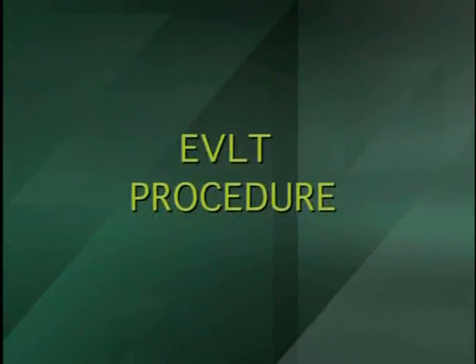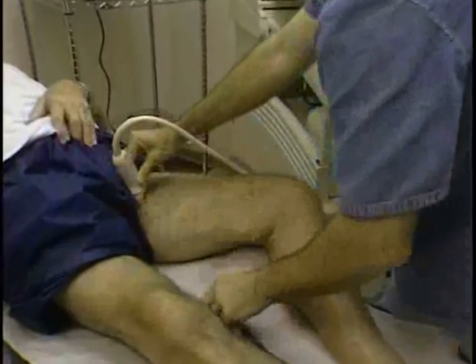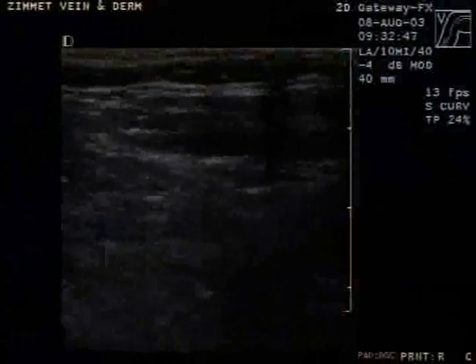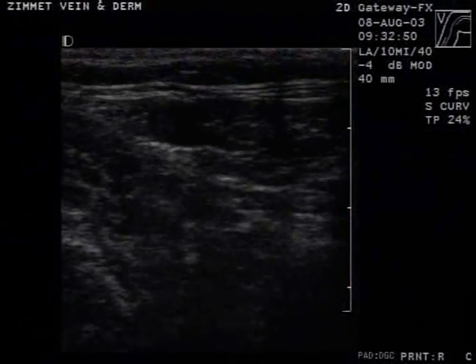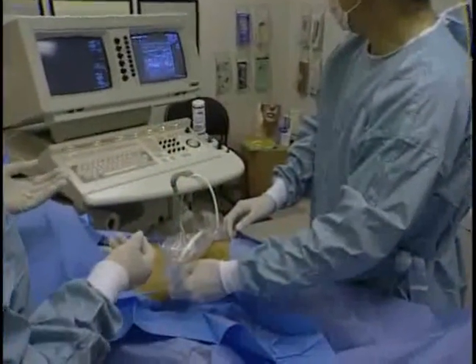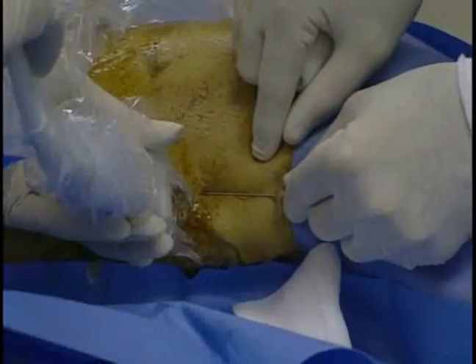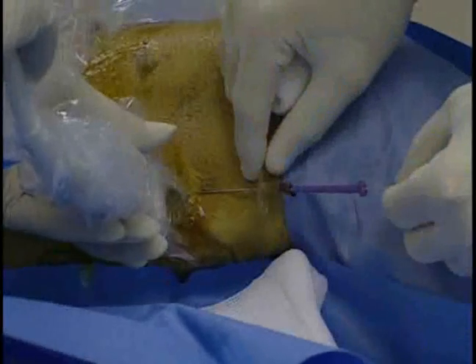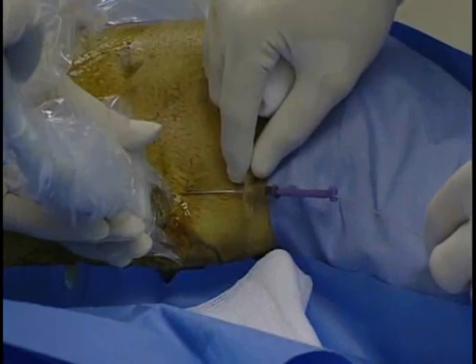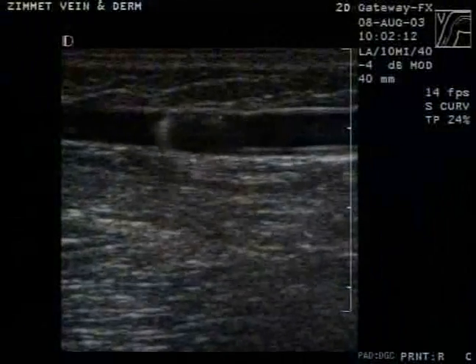The major steps in EVLT include: duplex ultrasound is used to mark the skin overlying the incompetent portion of the GSV starting at the SFJ. The area to be treated is prepped and draped. Percutaneous needle access of the distal aspect of the incompetent segment of the GSV is obtained under ultrasound control. An 035 guide wire is placed through the needle up the GSV into the CFV. The position of the guide wire is verified with ultrasound.